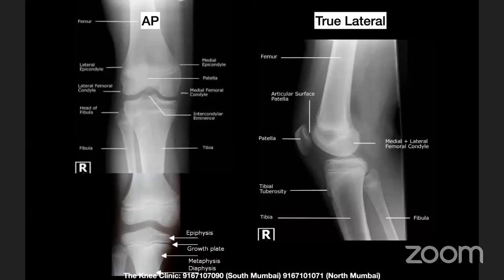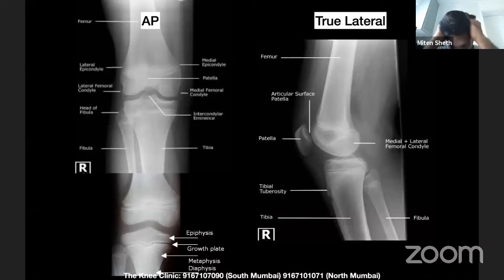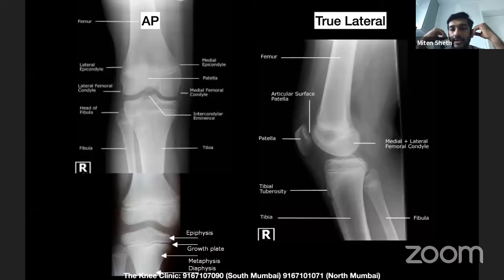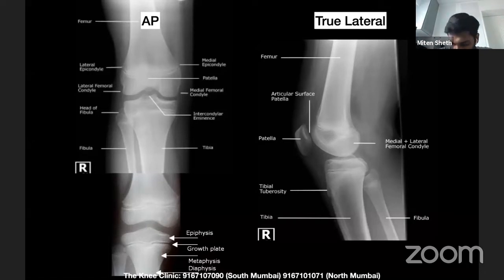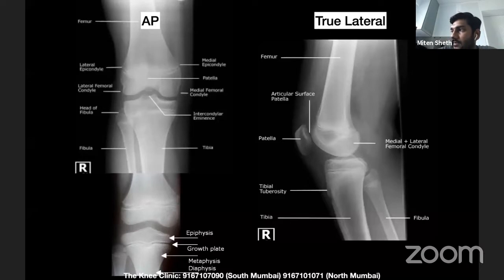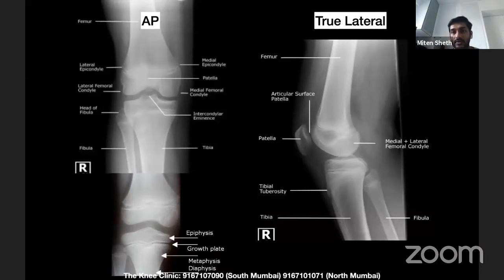Most adolescent tibial plateau fractures are Salter-Harris type 5, where there is a lot of physeal injury but you can't see the condyles breaking off. There are also certain peculiar avulsion fractures. It's important to treat these patients with growth remaining in mind — all boys less than 16 and all girls less than 14 must be treated differently because the knee is the predominant part of growth and they cannot be treated like adults.